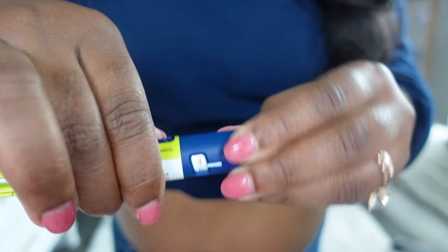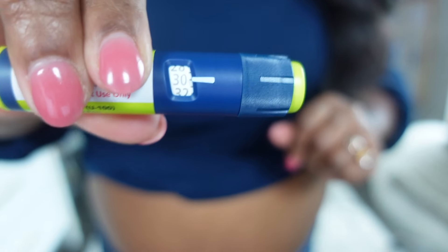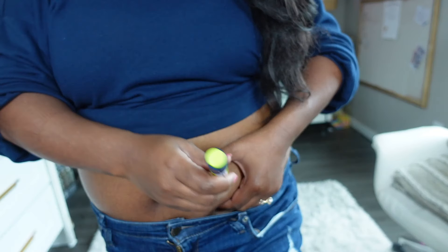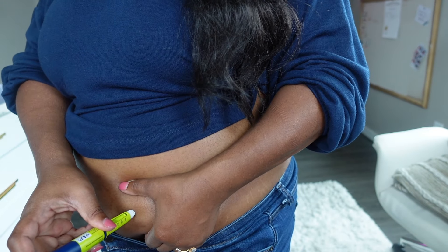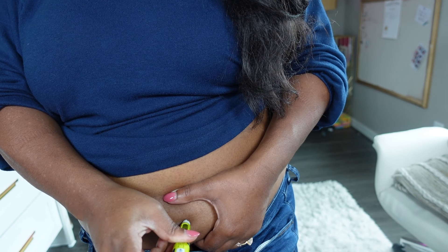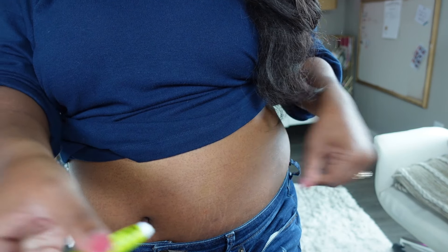Turn the dial to the number of units that you need to take. I take 30 units of Tresiba each day, once a day. Then grab the skin that you cleaned and swabbed, and push the needle in — I tend to go pretty fast. It's in there, and then push down until that last click. It'll click all the way down until it gets to 0, and then just hold it there for a few seconds to make sure you got everything out. Then pull it out — you don't want to wiggle it around — and you're done.